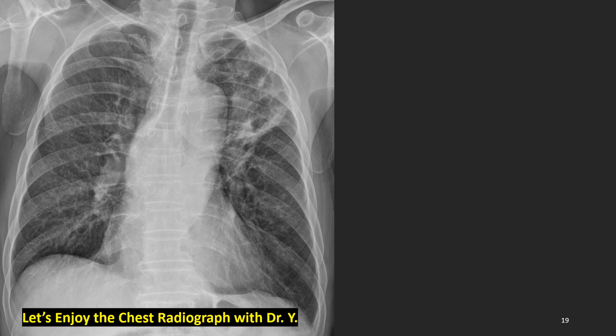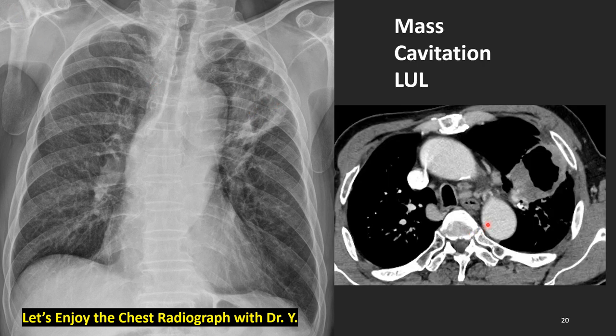We remember this image. What do we see? Yes, large mass with cavitation in the left upper lobe. We know this is the left upper lobe because of the fissure. Axial contrast enhanced CT of this patient: large mass in the left upper lobe, irregular thick walled mass with central large cavity. Mass, peripheral type, cavitation, left upper lobe. Yes, one of the typical features of squamous cell carcinoma.